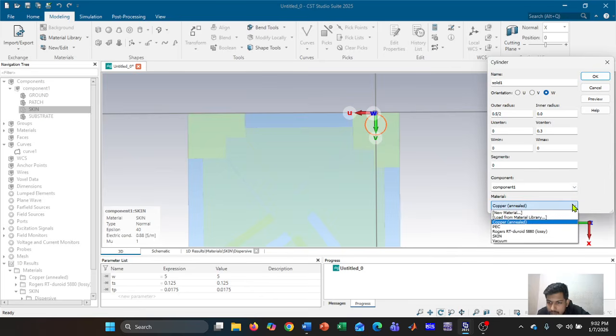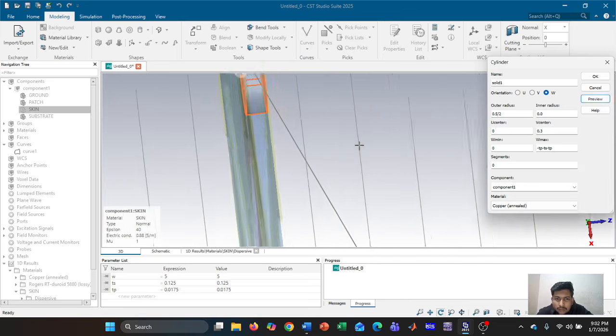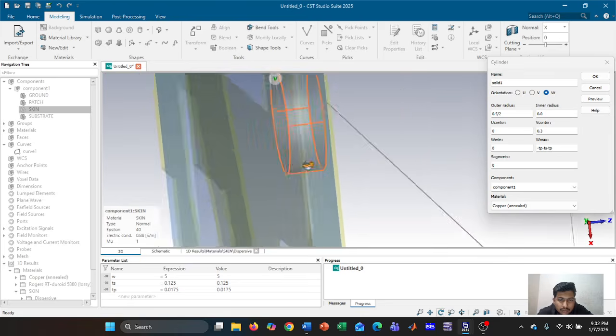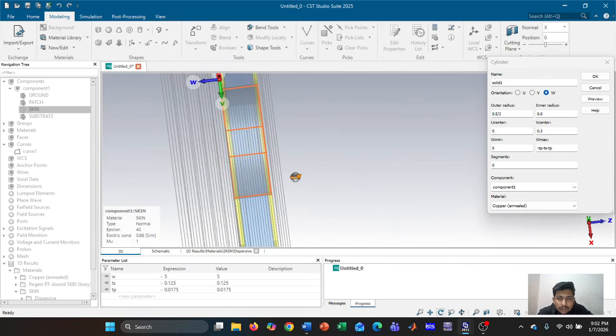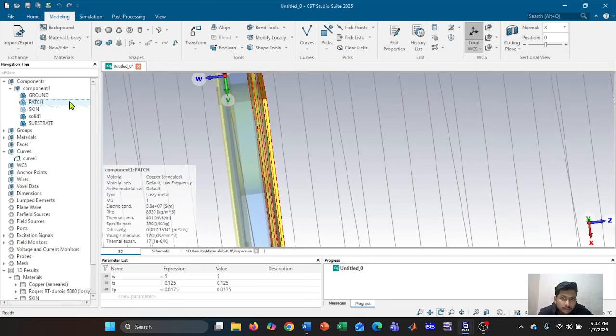Copper. Okay. And Wmax would be minus TP, thickness of the patch, minus TS, thickness of the substrate, and minus TP, thickness of the patch again. I can preview the thickness I made to connect these two patches together, the ground patch and the main patch, so it can be shorted. Click OK. So this is our patch.